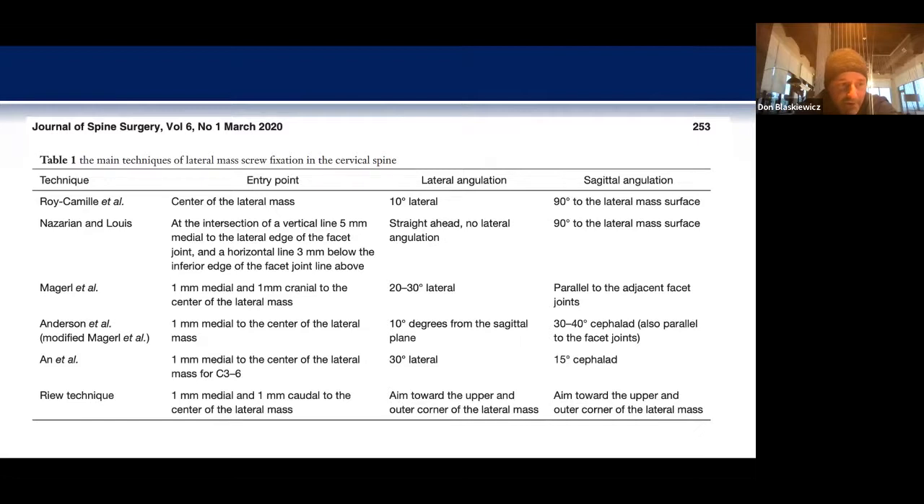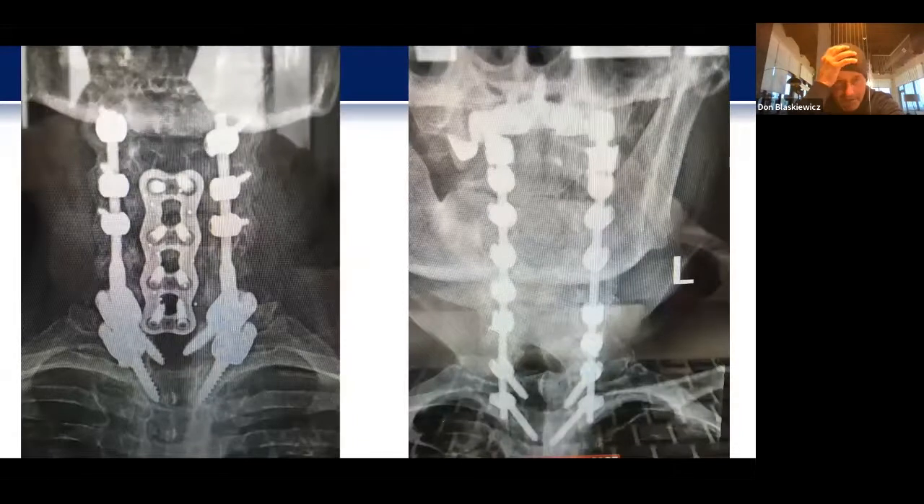When we perform posterior surgery there's a lot of dysmorphic bone, and if we merely try to estimate medial-lateral and cephalad trajectories of our drilling, this can lead us into spaces we don't want to be. The Riew technique puts the screw exactly where it needs to be every time. When selecting entry points, be mindful of how you'll link everything together — sometimes you may have to cheat your entry point medially or laterally, provided you have enough bone mass for fixation, just so everything lines up at the end of the case and avoids difficult rod contouring with the cord exposed.